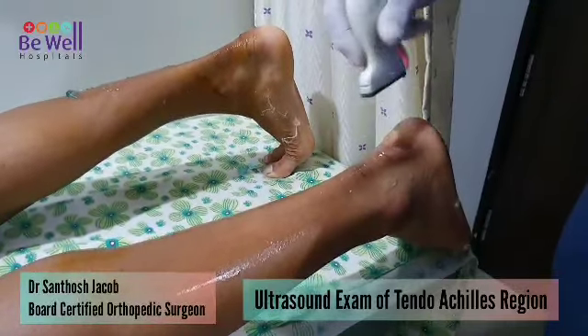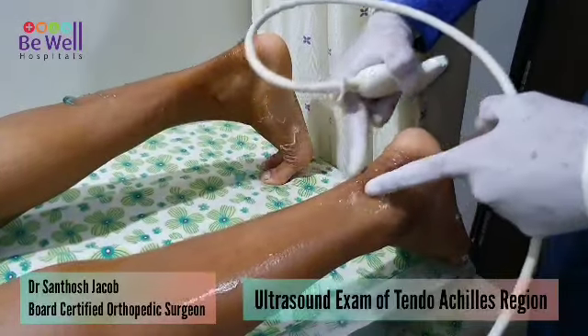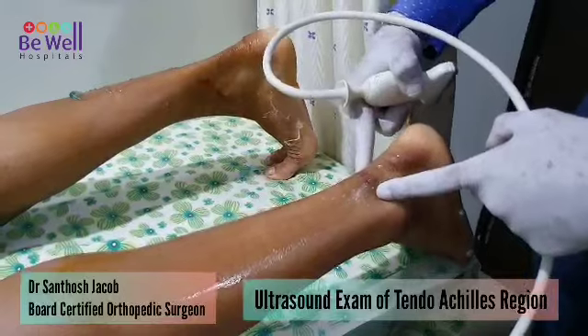Good morning. This is a post-op check using an ultrasound of the tendo Achilles and the calcaneum and the retro-calcaneal region.